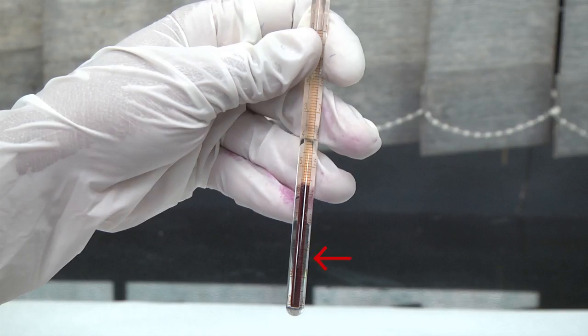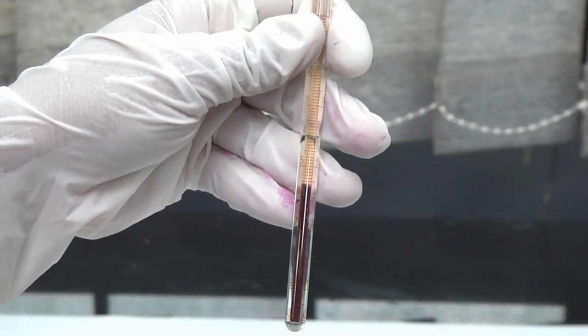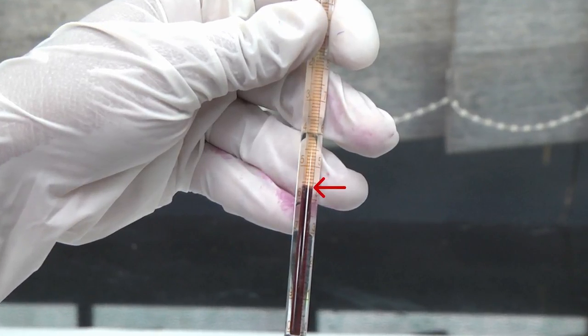The red cells are seen packed at the bottom, and a straw-coloured column of plasma is seen above that. In between, there is a greyish-white layer consisting of WBCs and platelets. This layer is called the buffy coat and is 0.5 to 1 mm in thickness. Read the level at which erythrocytes meet leukocytes.